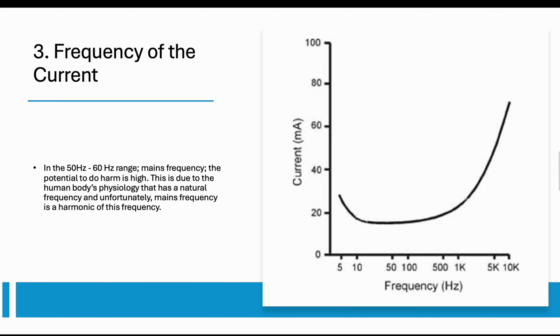So the potential to do harm, in the event of a contact between us and mains, it could cause physiological effect.